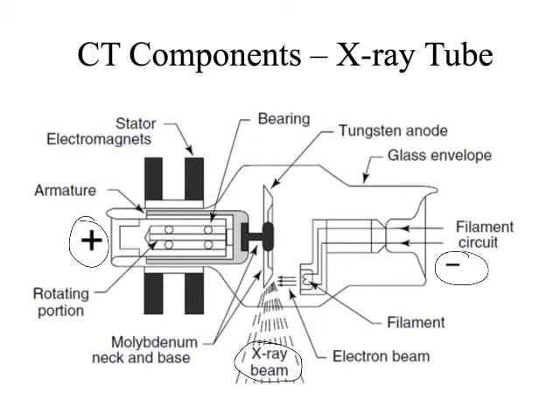What's the primary way that it gets those X-rays out? What's the number one interaction that occurs that produces the diagnostic X-rays? Is it annihilation? It is not. Keep guessing though. Is it excitation? It is a form of excitation, but specifically bremsstrahlung. It is a brems. Have y'all talked about brems yet? Okay, good, good. I knew, every now and then it's good to figure out where the overlap's occurring, right?